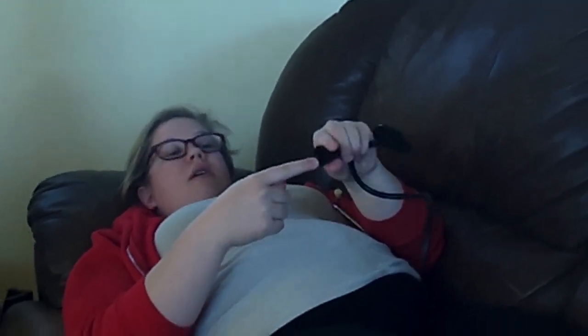So the only other thing to really keep in mind when you're listening is that anything that's touching, here on the fetoscope, this middle part, really anywhere on here, and the tubing is going to make sounds or interfere with the sounds which you're trying to get from here. So a lot of people sort of hold it like this, and you might still be able to hear it, especially later on. But really, if you're listening for the really, really faint sounds that you're going to be hearing early on in pregnancy, it's best to just kind of only touch here.